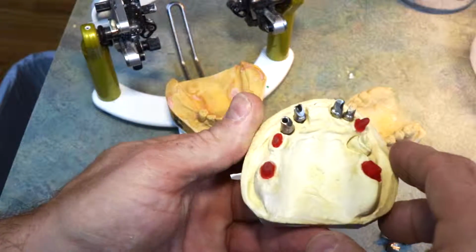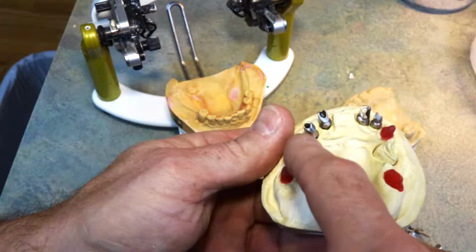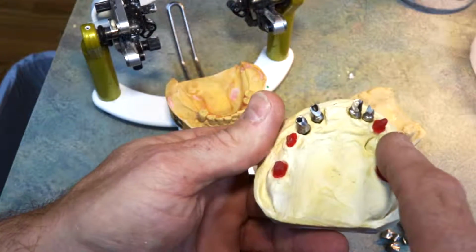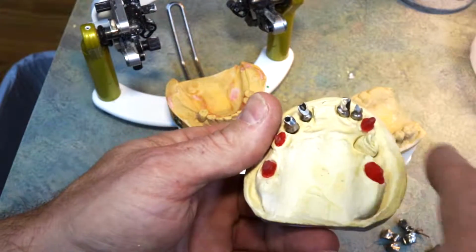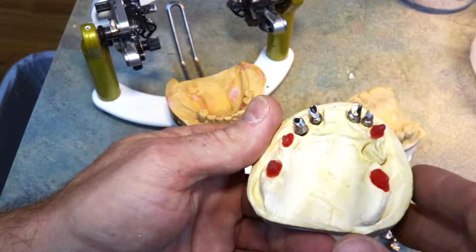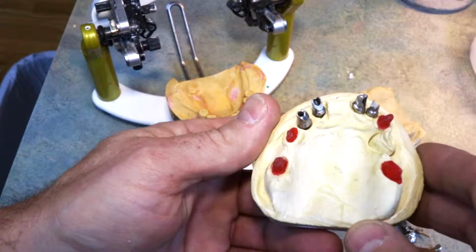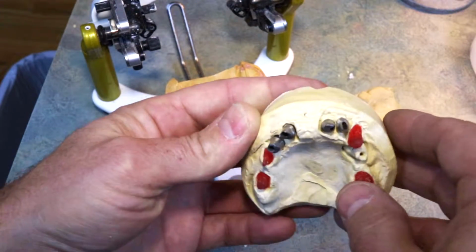And at this point, I am ready to start the process of drilling holes in each one of these, and tapping in some screws, and making the superstructure framework that goes over this. I will pick it up with another video when I get that done, maybe in the middle of doing that. So that's it for now.